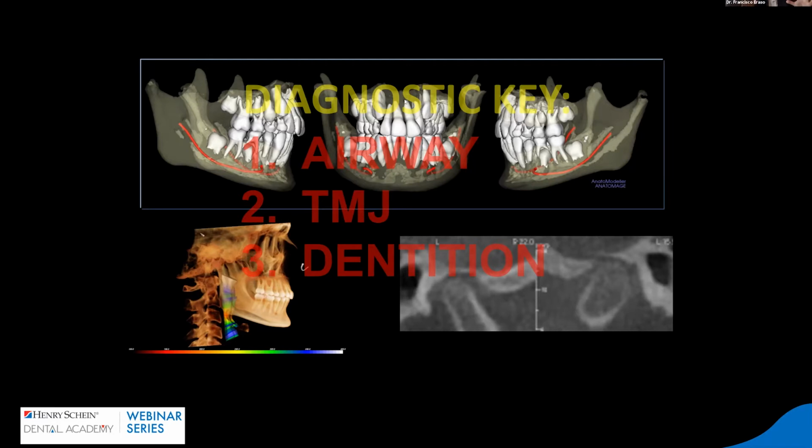So now we are going to treatment plan. Before, remember, we said we're going to do an indirect bonding treatment plan, and we only have the models, and we position the brackets on the models, and then we deliver those indirect bonding trays. Today, you have the ability to introduce the CBCT in that treatment plan for the indirect bonding.